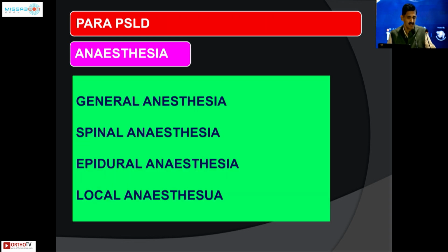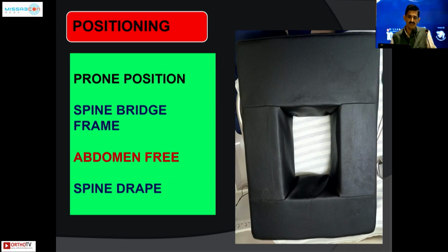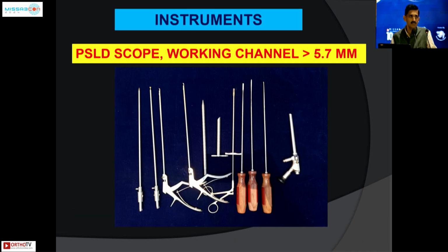Coming to para-PSLD, you can do it under general anesthesia or regional anesthesia. We don't prefer local anesthesia. Positioning is standard, the way you want. Instrument, we require only standard PSLD instruments.